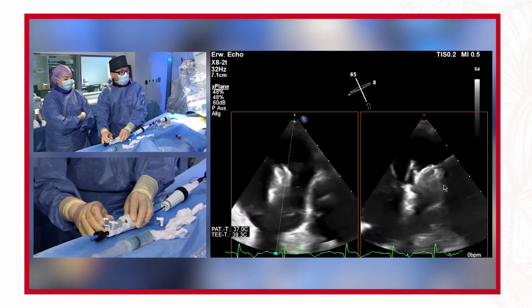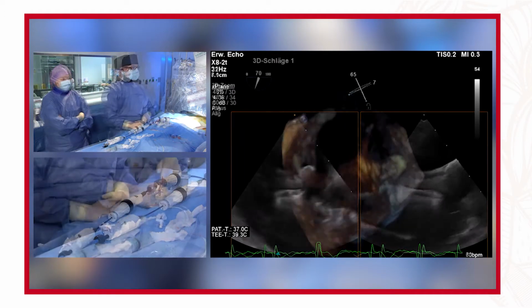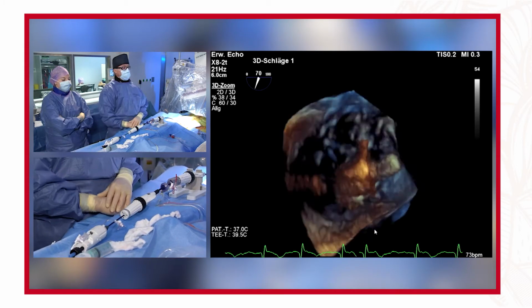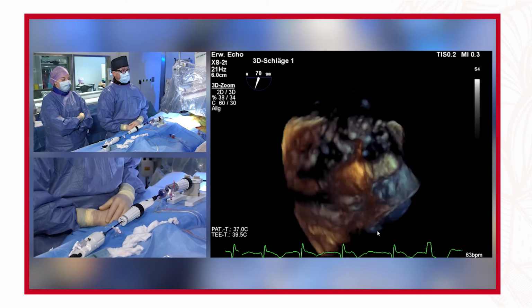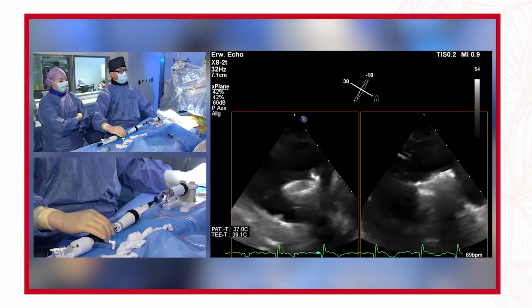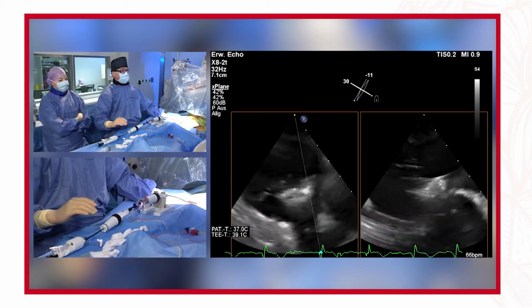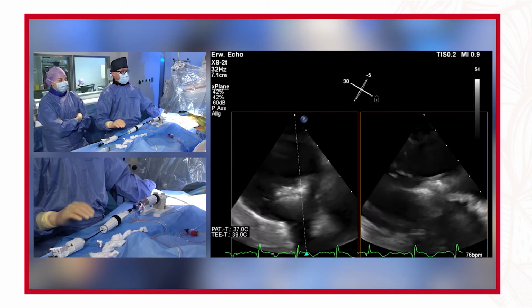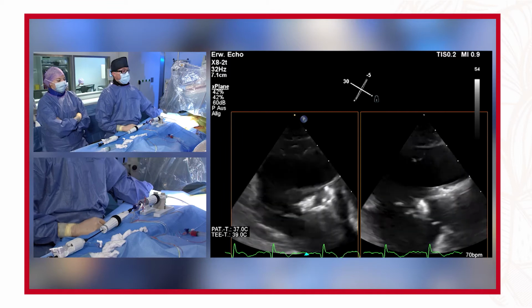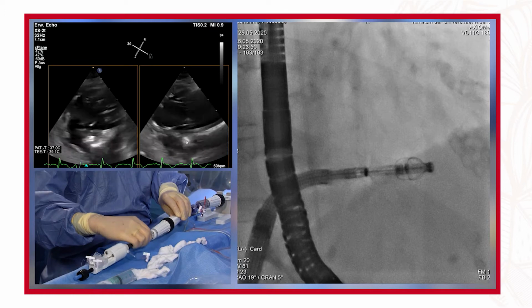You have seen the septal leaflet now in the shadow of the beam, you see the actuation of the anterior clasp. The 3D helps us in the first orientation while the system is still on the atrial side to get a good perpendicularity to the line of coaptation. You see here, this is being finally checked in the transgastric view. So we want to place the PASCAL system as centrally as possible in the anteroseptal line.